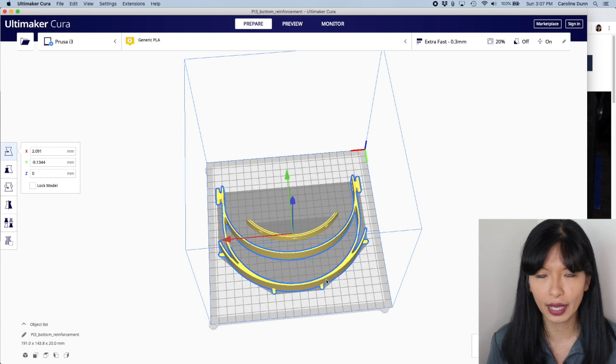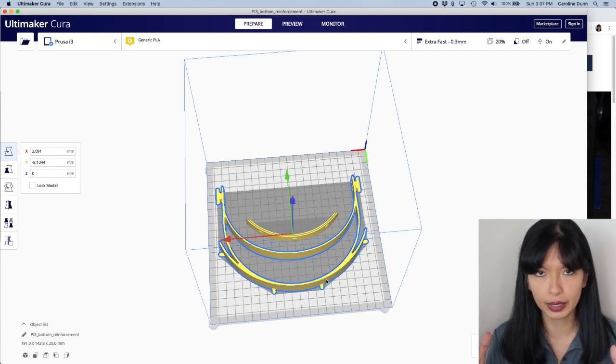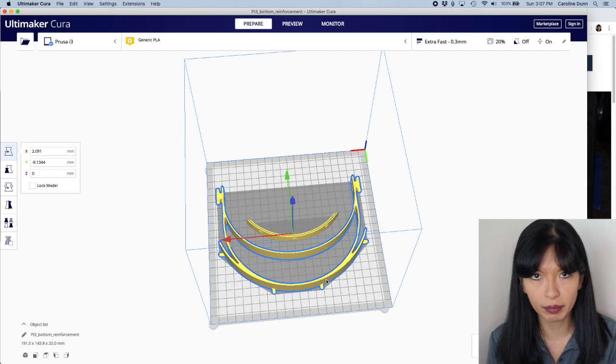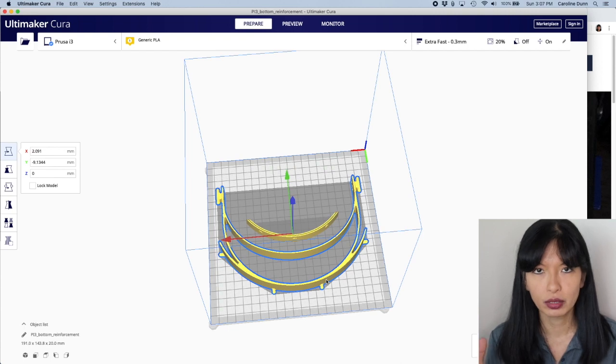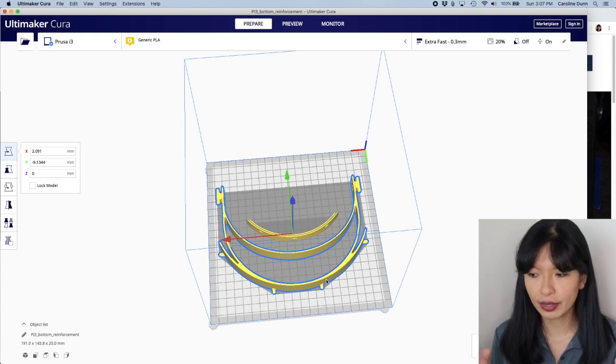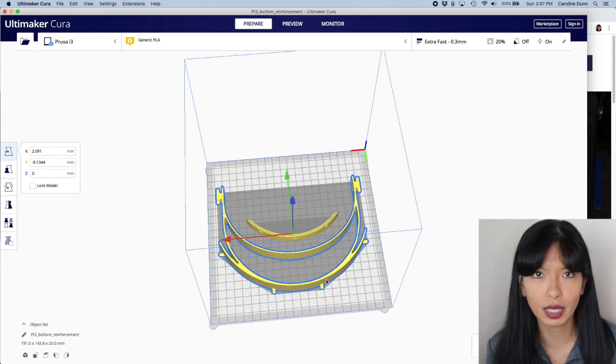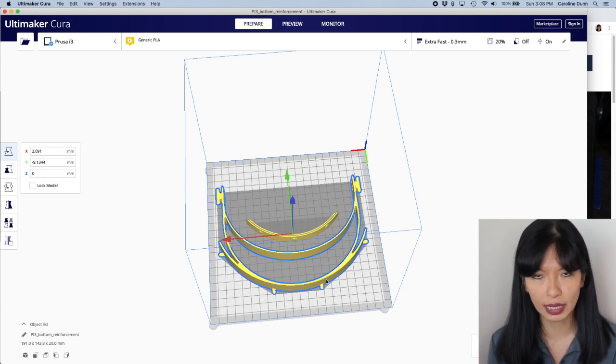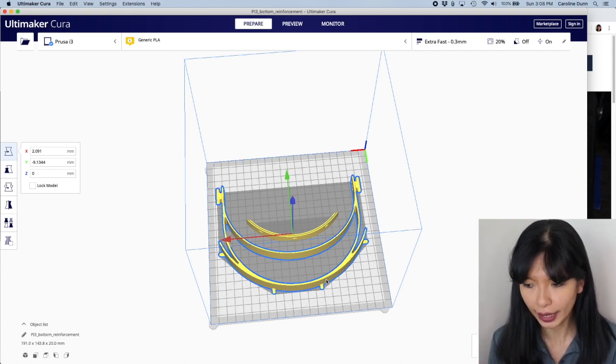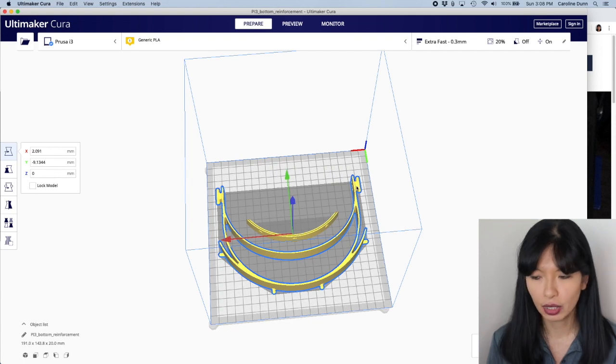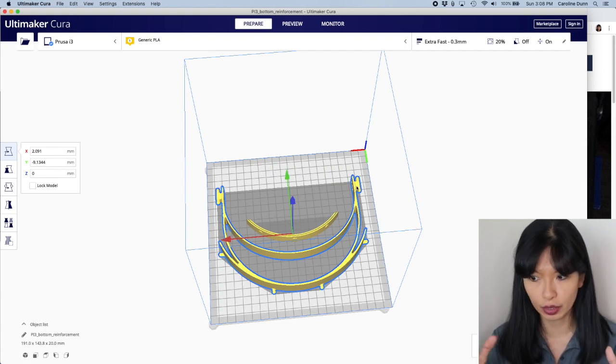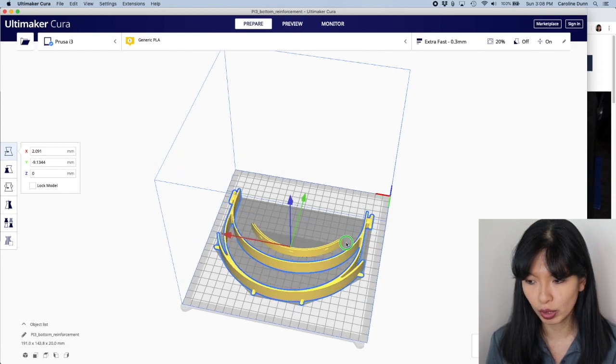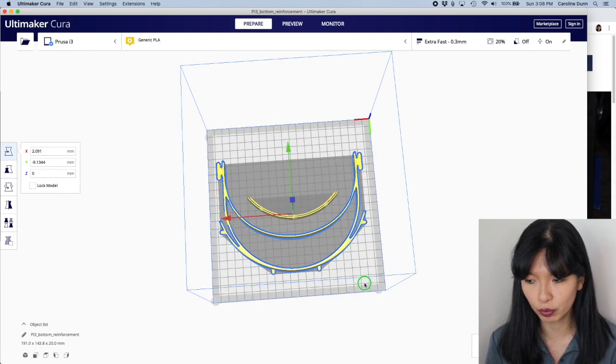And then we're going to turn this around and you are going to see what this looks like. I do want to note that I have an Anet A8. The build plate is 220 millimeters by 220 millimeters, 22 centimeters by 22 centimeters. I think that is about the minimum size you need in order to print this particular design out because it's almost to the edge. So you want to make sure your build plate, that you are able to print all the way out to the edge.